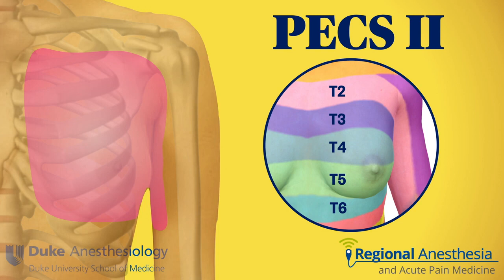The intercostobrachial nerve, a branch of T2, is also consistently blocked, and we commonly add this block to a brachial plexus block for additional skin coverage during AV fistula creation. Note that the midline of the chest is spared because we don't get the anterior cutaneous branches with this technique. That's easily fixed with some additional local infiltration in that area.